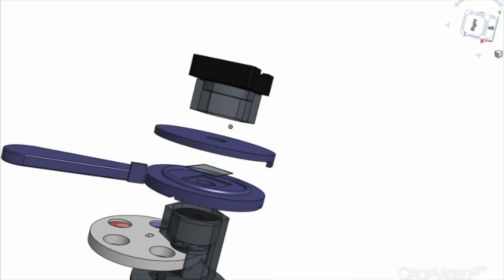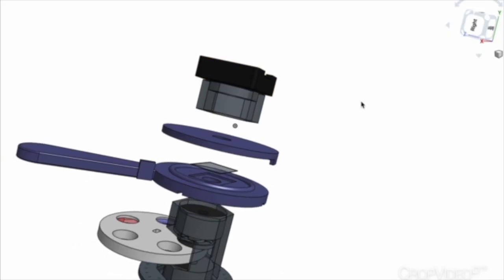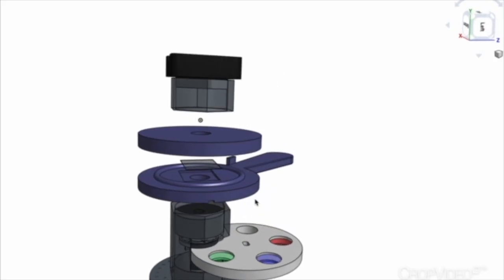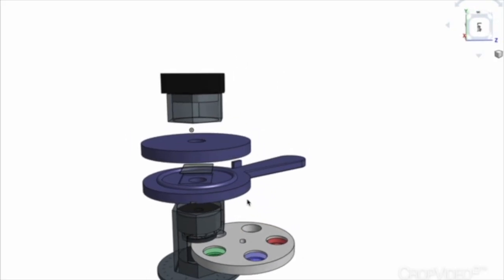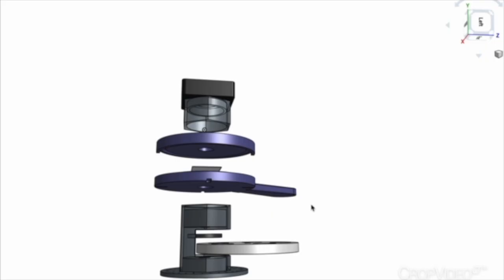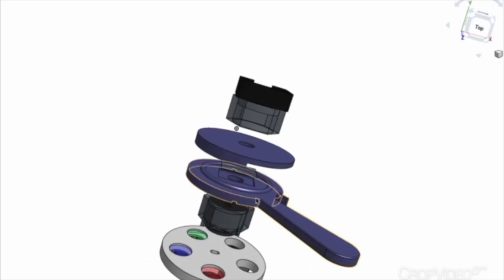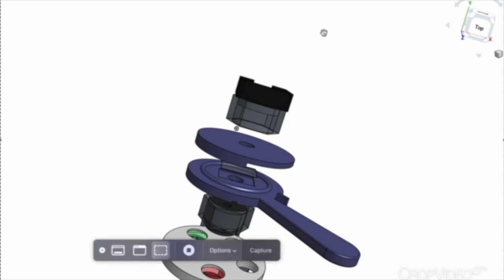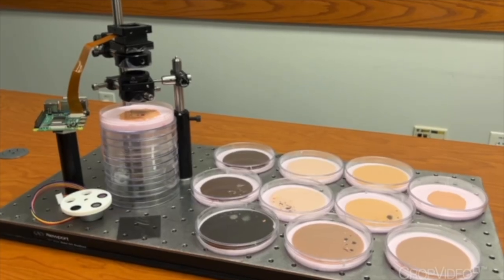The gray components surrounding the stack now form the main enclosure. They keep the optical elements aligned and block stray light from reaching the camera lenses. On the base, there are small holes for the LEDs, and as I rotate the model, you can also see the aperture and optical filter wheel sandwiched between the lenses. This CAD drawing does not include the electrical hardware, LEDs, wiring, or PCBs, for example, but will be added onto this and completely enclosed in the main housing unit around this optical stack. Next, we'll show how we tested these optical components before 3D printing the enclosures based on our measured dimensions.